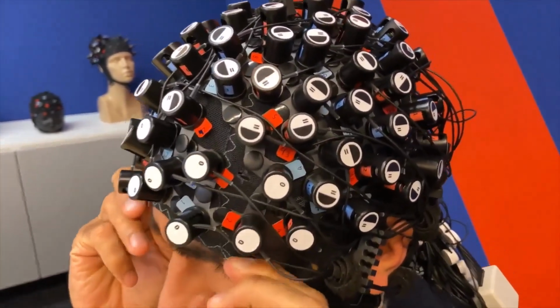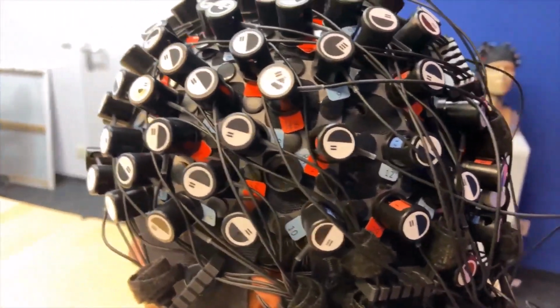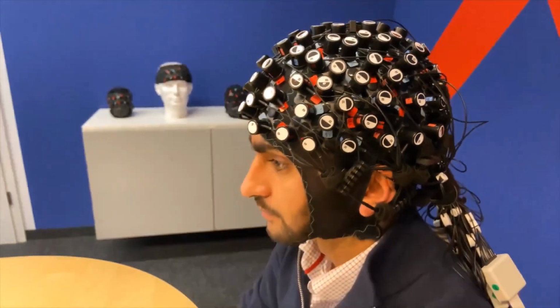So you can see it's quite a few probes, but the more probes you have, if you intersperse them with each other, you can get higher resolution imaging, and we'll talk more about that later.